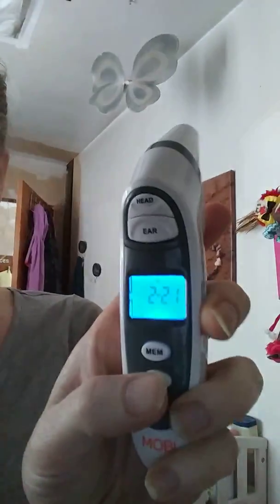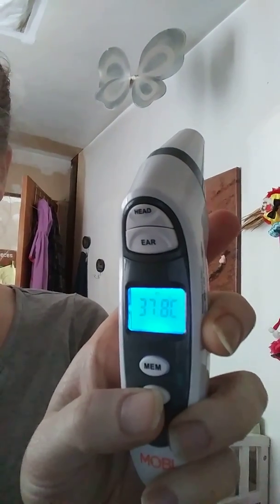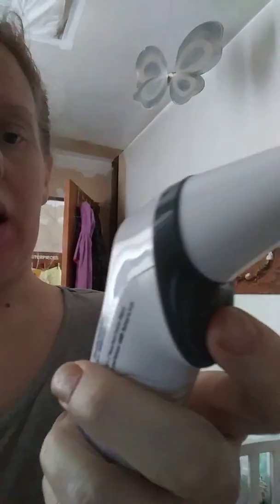It wasn't accurate at all. But it's up to you guys if you want to try it — this is just my opinion. It shows the time and the temperature, and you can choose Celsius or Fahrenheit. I usually go by Celsius.